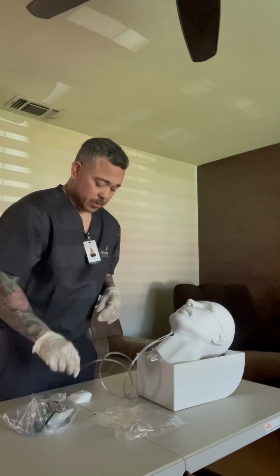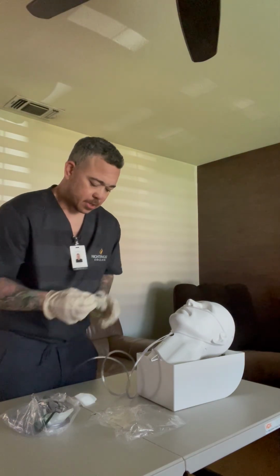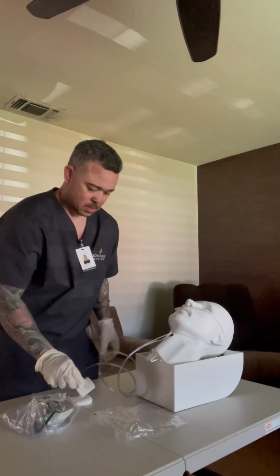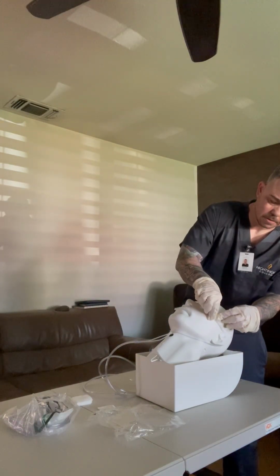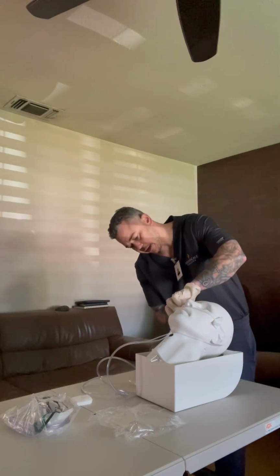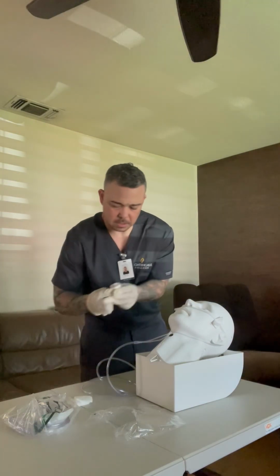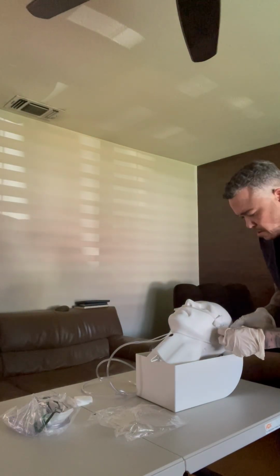Now, if there is, what I can do is take gauze, and we can put a piece of gauze here on the cheek. Okay. I can put another one on this side of the cheek. My mannequin is a little unstable. I'm trying to keep it stable. Okay, and then I could put one around the ear as well, because he can get skin breakdown on the ears. And then one on this side of the ear as well. Okay, perfect.